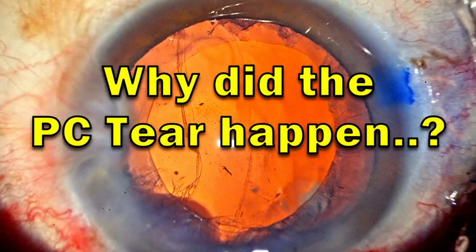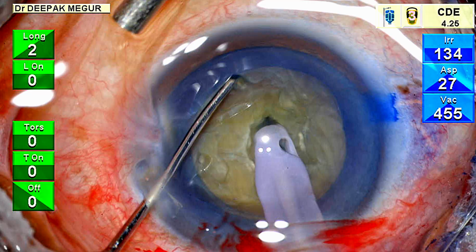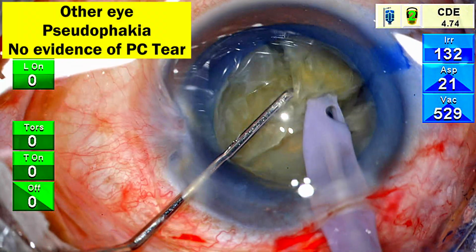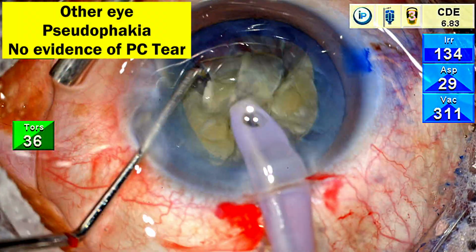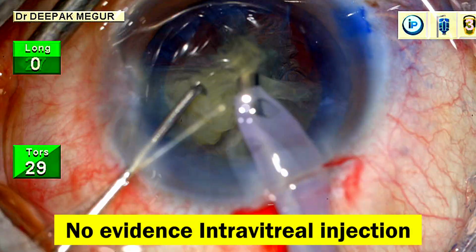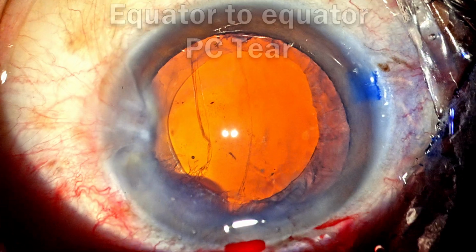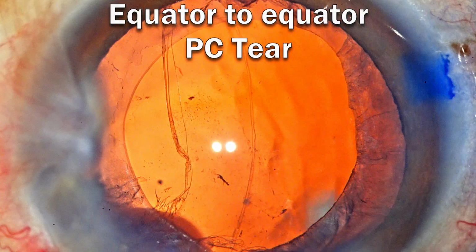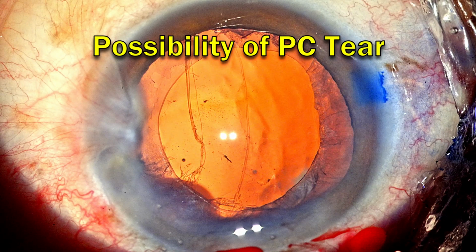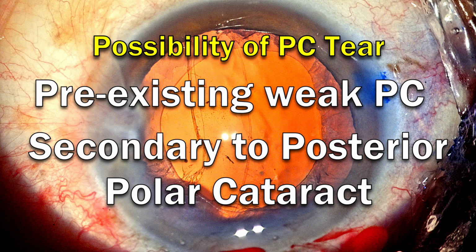So back to the question of why did the PC tear happen, I am not sure. Possibility of this being a postpolar cataract, the other eye was pseudophakic and there's no evidence of PC tear in that eye. There's no evidence of any intravitreal injection being given into this eye, so I'm not so sure. But looking at the configuration of the posterior capsule tear, equator to equator, a linear split, it looks like possibly a weak pre-existing posterior capsule secondary to postpolar or something else. I don't know.